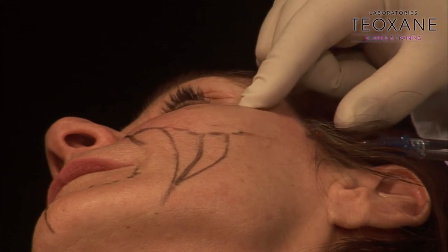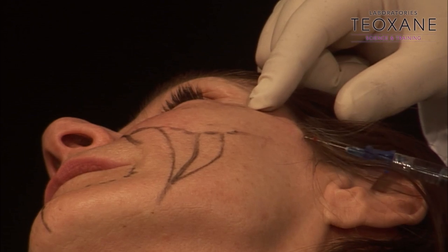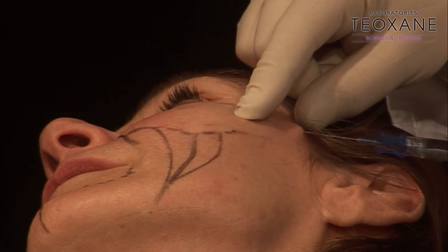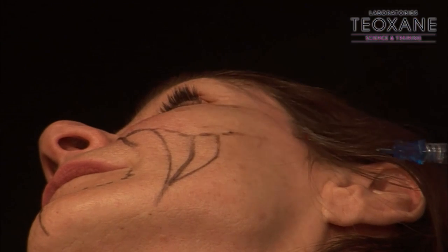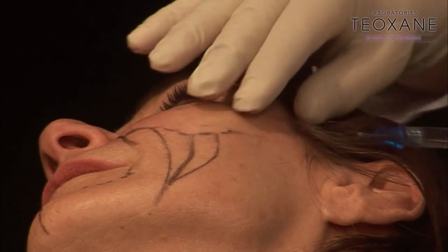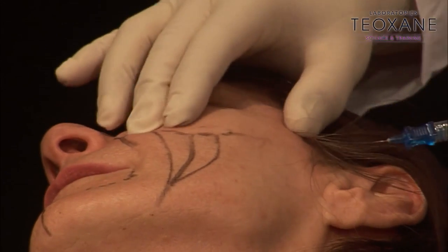I don't go in the eye socket. You see, that would be a mistake, because then they will have some bubbly gel popping out in a few days if I do that. So I try to avoid this area, because when she sleeps, your head on the pillow is pushing the filler. You have to be just quite gentle.